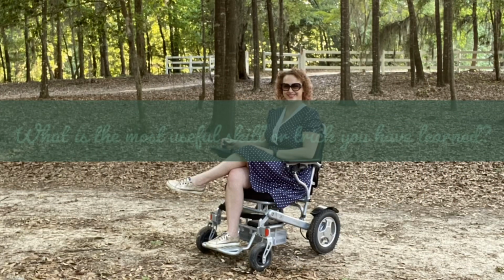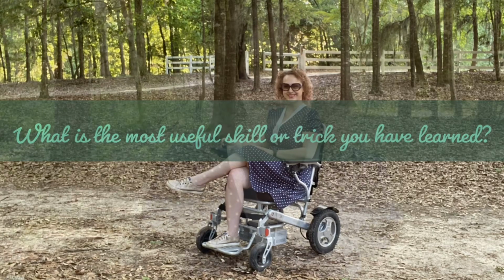The next question is, what is the most useful skill or trick you have learned? And for me, that would be getting out of the sand when I get stuck in the sand. Fortunately, I'm still able to kind of use my right leg to push myself out, or Joseph helps me, or I just get out of the chair and kind of wheel it on out.